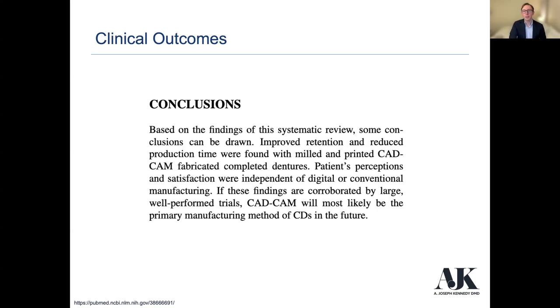I know NDX has some great solutions with that too, as do many labs. Patient perceptions and satisfaction are independent of the digital or conventional manufacturing. I don't have any studies here tonight, but from my lit review, over time, there was a really good study where they looked at 30, 60, 90 days of patient quality of life and their self-reported happiness with their denture, with CAM fabricated dentures and conventional dentures. And what they found is that over time, both of those dentures ended up being at the same level.